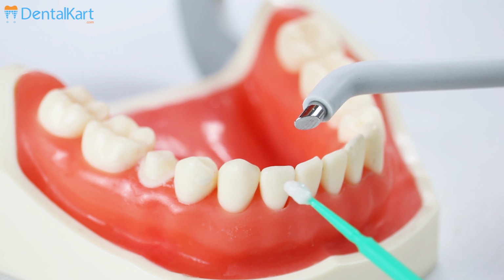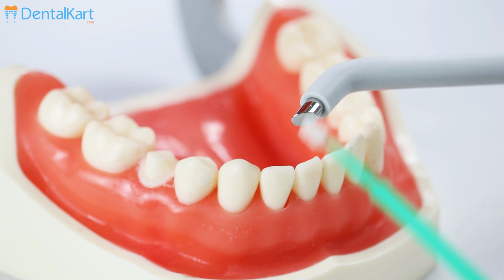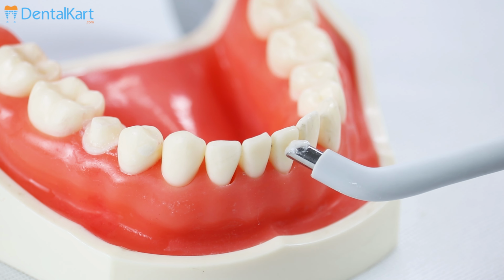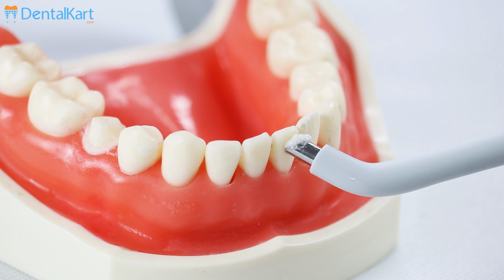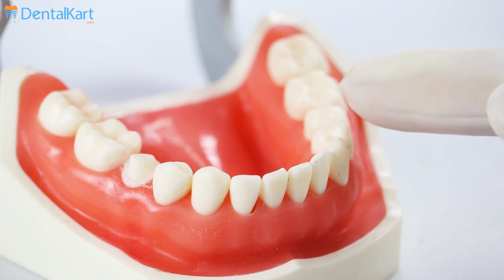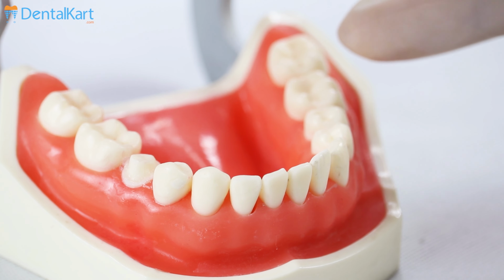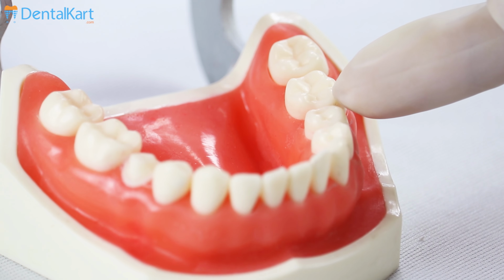Apply an electrolyte, it can be a prophylaxis paste or a toothpaste, on the test electrode and place it against the dried enamel of the required tooth. The placement of the test electrode for the incisor teeth is on the incisal third, for the premolar it's on the buccal cusp, and for the molars it's on the middle third of the mesiobuccal cusp.